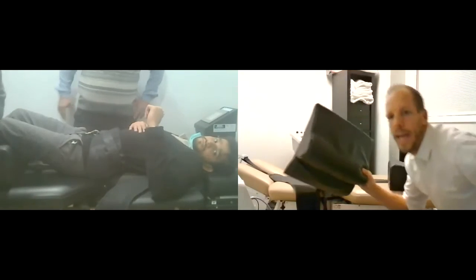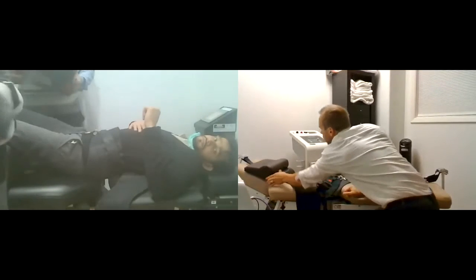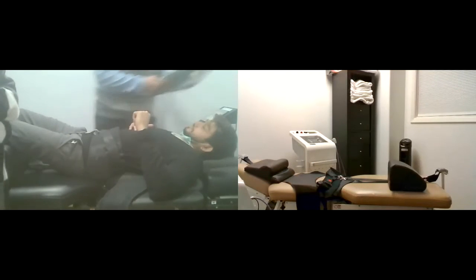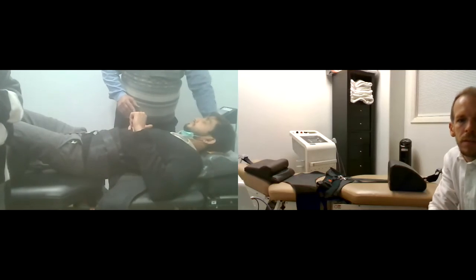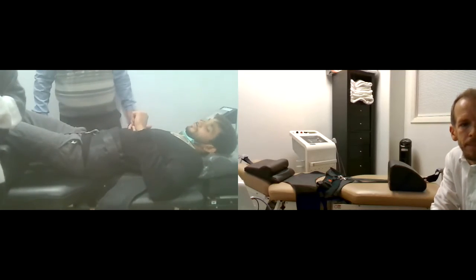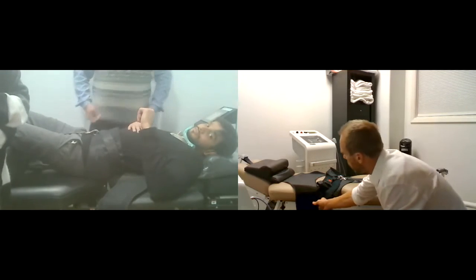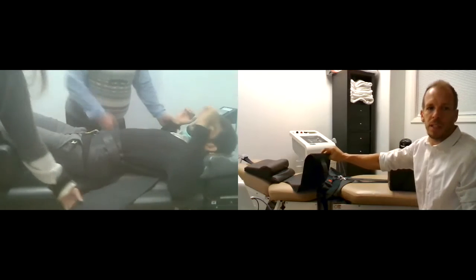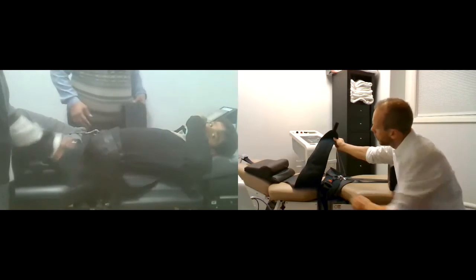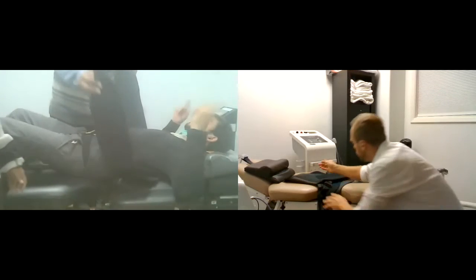There should also be a head pillow for under his head. Okay. Yes. Next, what we want to do is we want to do the thoracic harness. Okay. This one is going to come around and down to make an X.